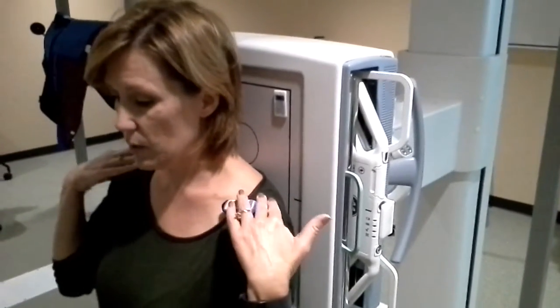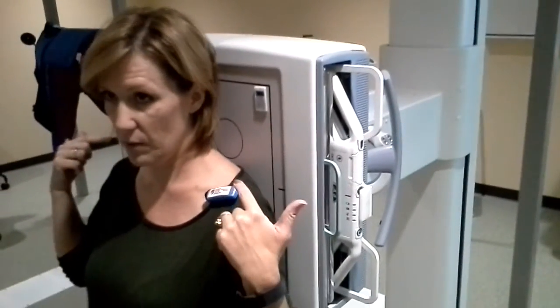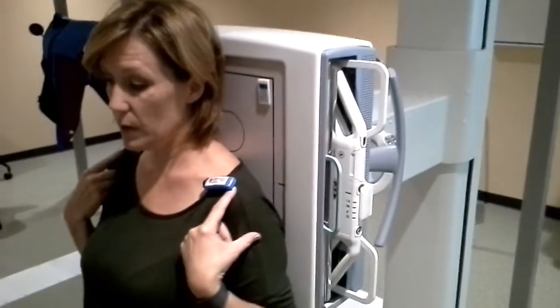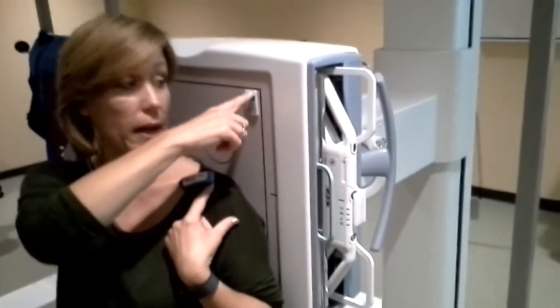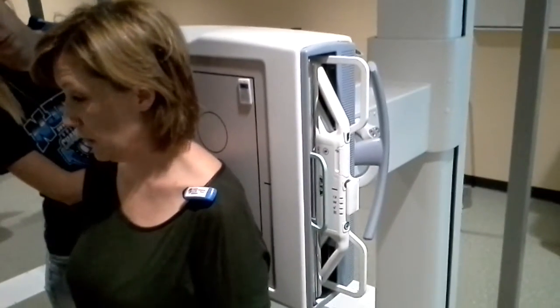And what I like to do for a lordotic chest is before I have them lean back, I want to do my best to set the height of the wall bucky. So what I find works well is if I line that black line up to about the top of the patient's shoulders. So yeah, just go ahead and you can lower it down.